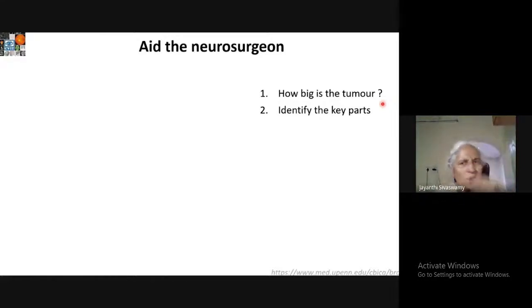So in this case also, this is a tumor region, and you want to automatically segment out and identify different parts of the tumor region. So what do you do? You take different modalities of MR, because each modality gives good contrast signal to different parts of the tumor. So these are the three different modalities in MR.